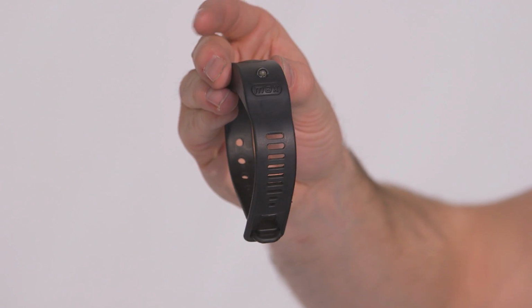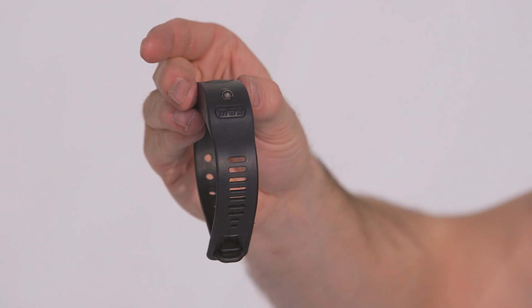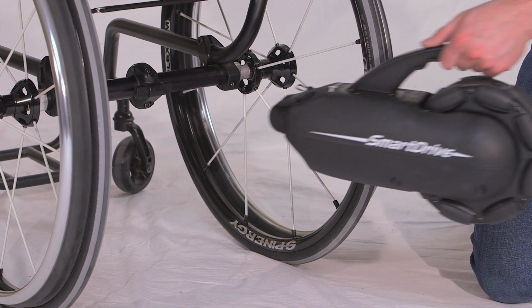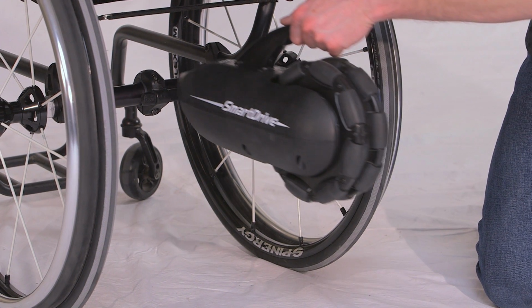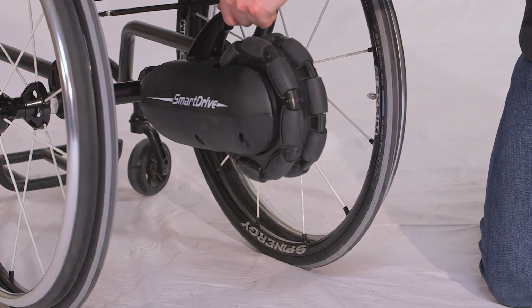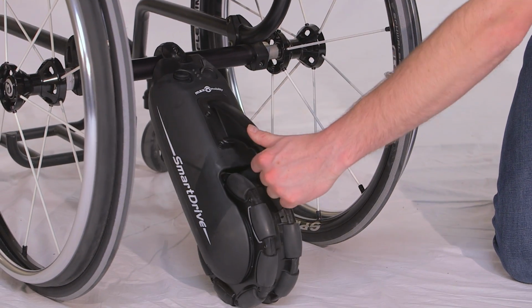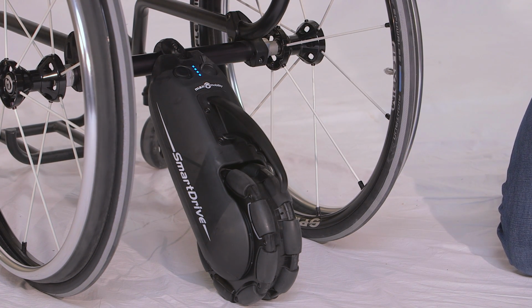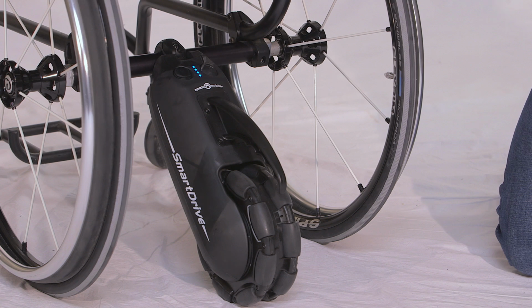Whenever handling your drive unit, you'll want to be sure your wristband is turned off. To put a SmartDrive on the axle clamp, you will need to hold the drive unit slightly higher than horizontal. Then simply lower the front end over the extrusions in the clamp. Next, rotate it down by letting it drop under its own weight, hit the power switch to turn it on, then you're ready to transfer into your chair and go.